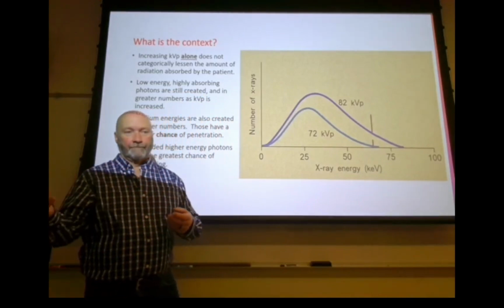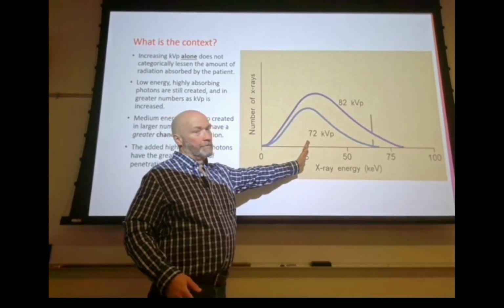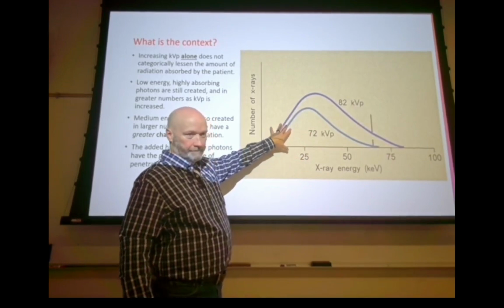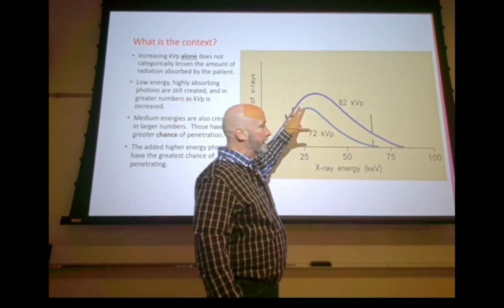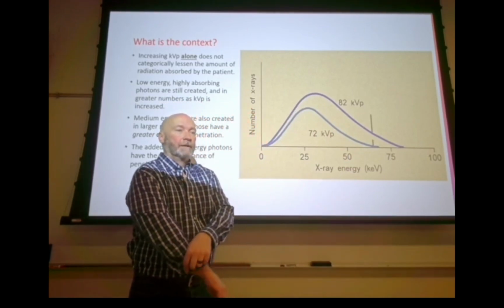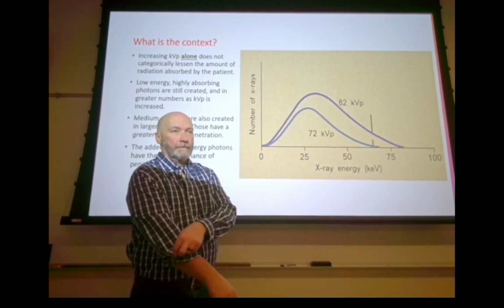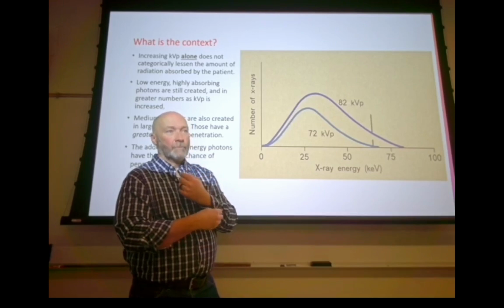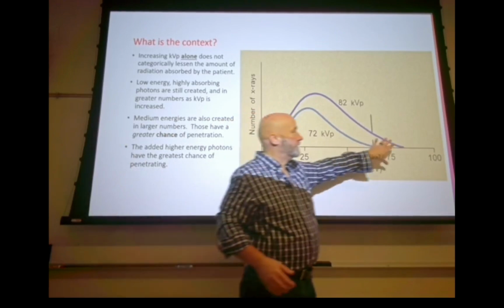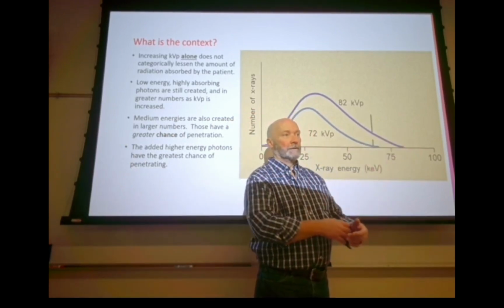Any of those can occur at any energy level. You know, realistically, you can penetrate a ridiculous number of things with 25 kVp. Skin, absolutely. Soft tissue, probably. But in general, this is the most likely occurrence at this level. With a higher kVp, the higher the kVp goes, the upper end is less likely to interact in any way.